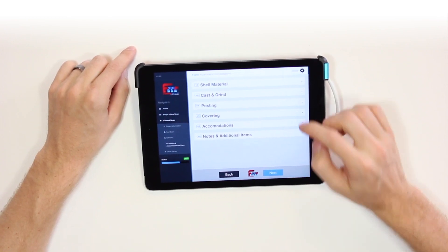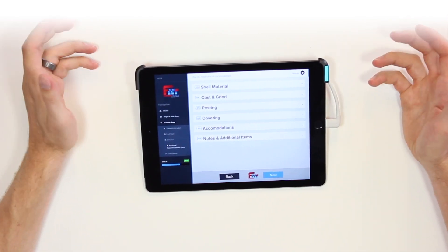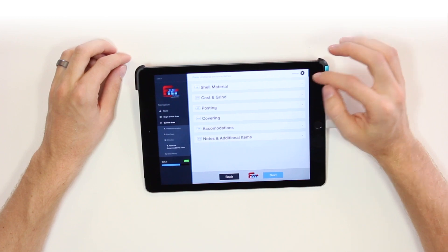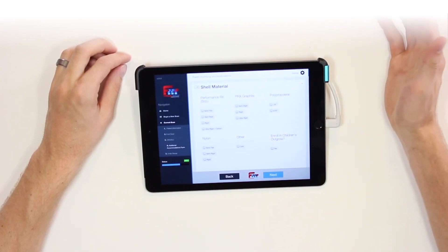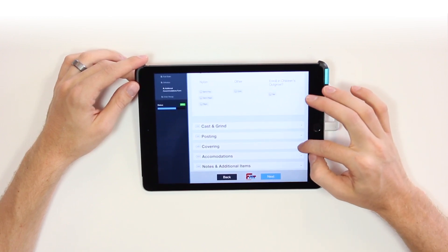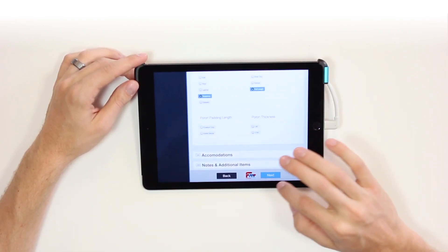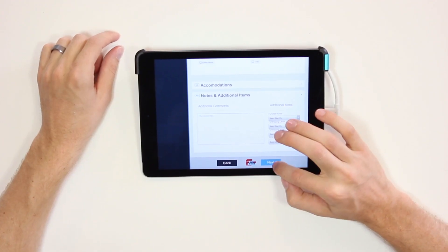This is our prescription form, mirrored after our standard prescription form. It has categories for shell, materials, cast and grind, posting, covering, accommodations, and notes. Click on one of these to open them up and select different device types and accommodations. For example, if we wanted to make the shell graphite, just select the graphite button. You can also change the covering length — say we want a full-length device with a neoprene cover. If there's anything you don't see on the form, you can mark it in the notes or ask us to call you. When you're ready, press the next button.